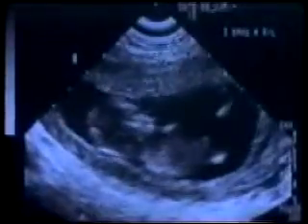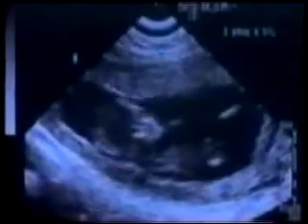Now the heart has again perceptibly speeded up. We can time this at approximately 200 beats per minute. And there is no question this child senses the most mortal danger imaginable. The membrane has now been punctured and the fluid has escaped. One no longer sees that large reservoir of fluid surrounding the child.